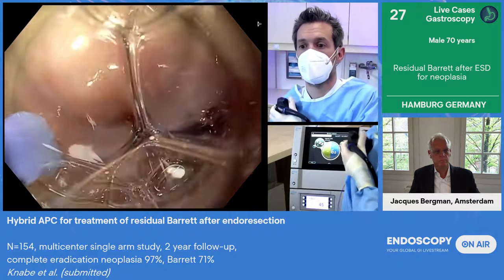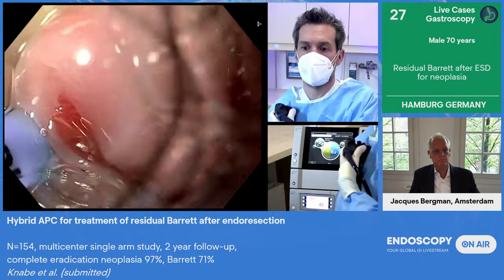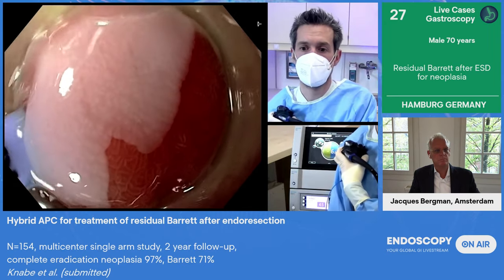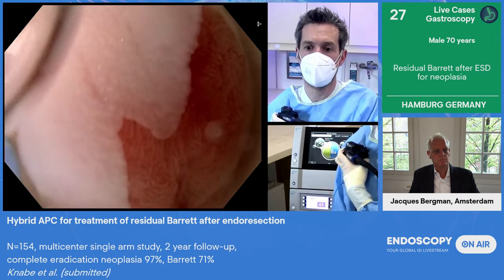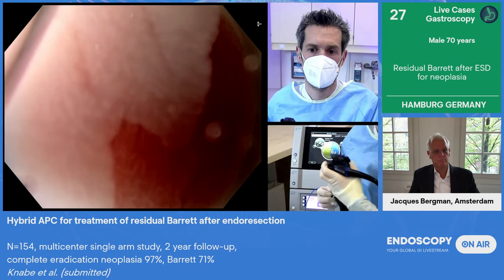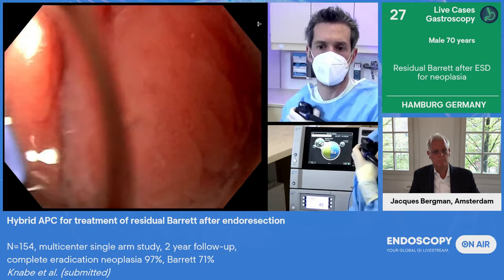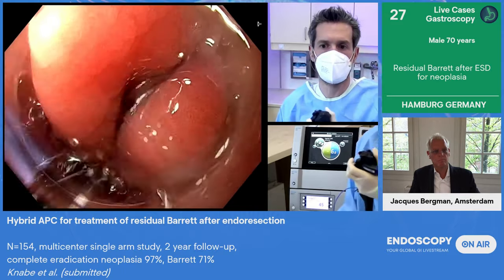Now we have to get a good position again, and we will start injecting here. I use the foot pedal again, and hopefully you can see the lifting sign. Yeah, quite close because of the scar. I have to go in this position, so it's not that nicely to see.